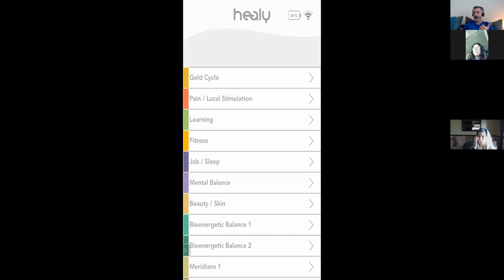Sometimes it's restarting your phone, uninstalling, reinstalling the app, rebooting the device multiple times. And sometimes people say, hey, when I do that, the first time it didn't work, the second time it didn't work, the third time, and the fourth time, all of a sudden, boom, my wife's device is working great now. So sometimes what you have to do is just kind of fiddle with it. That makes sense? And if you're super technically challenged, find a teenager and say, hey, this is how you reboot it. This is the app. Can you play around with this, restarting it, uninstalling, reinstalling till you get it to work? And that'll probably take them 5 minutes where it would have taken you an hour and made you want to hurt somebody.